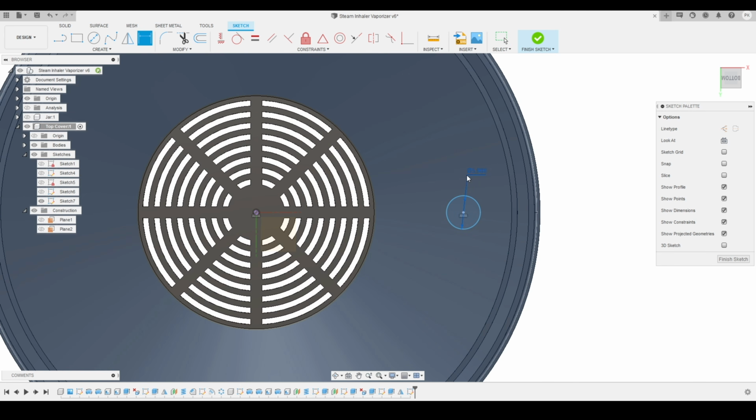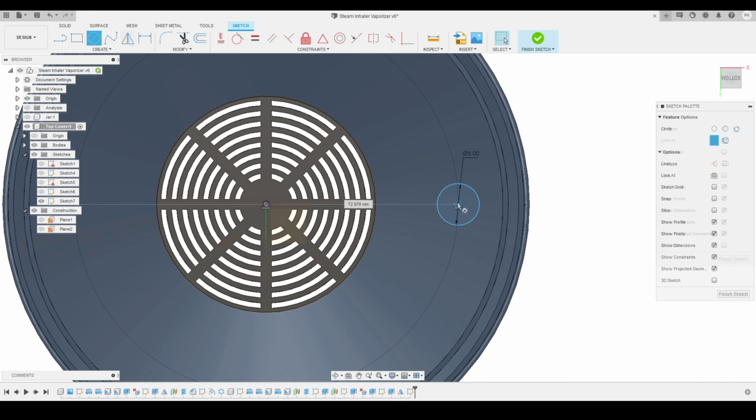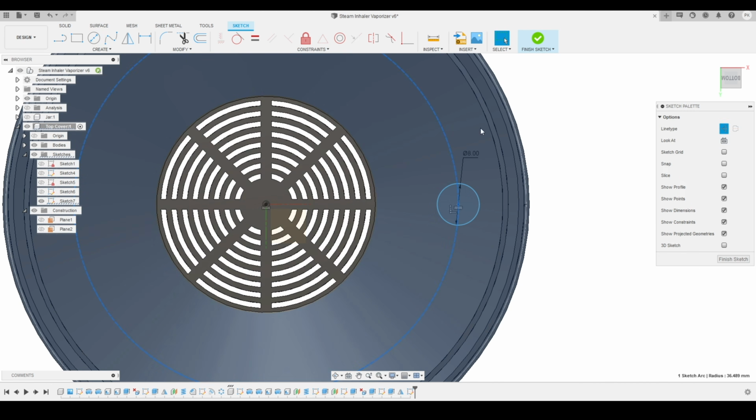Now I will define this circle diameter as 8 millimeters, and I will create one more circle that will connect to the origin of this circle, and will make sure that it is a construction line. And I will also define the diameter of this circle as 80 millimeters for now.